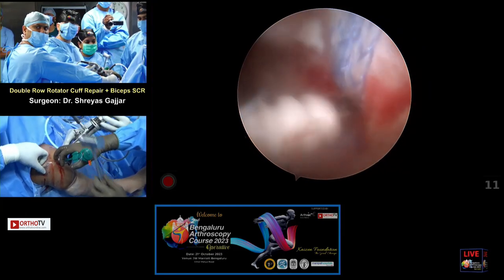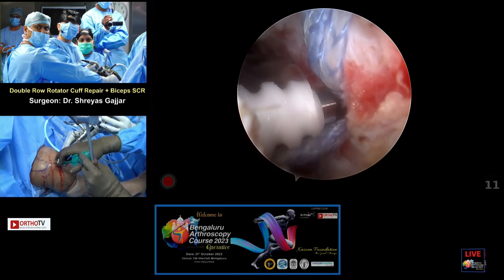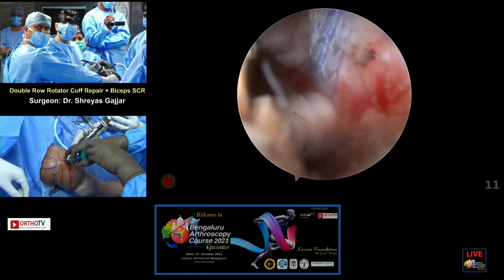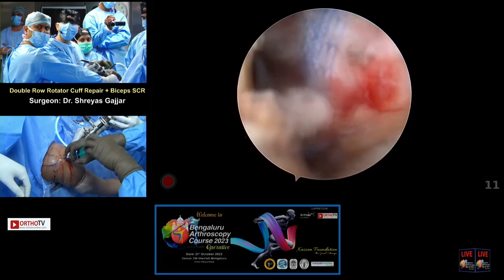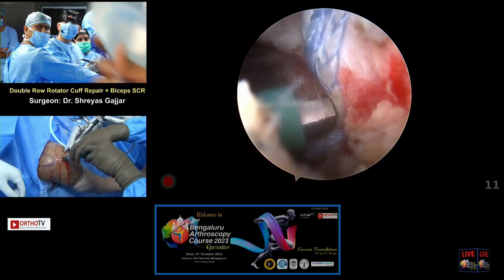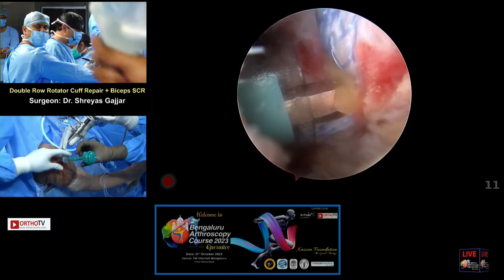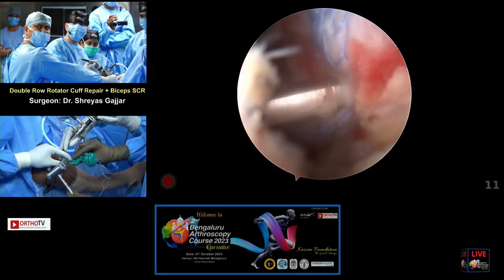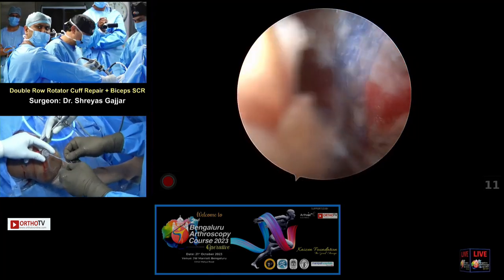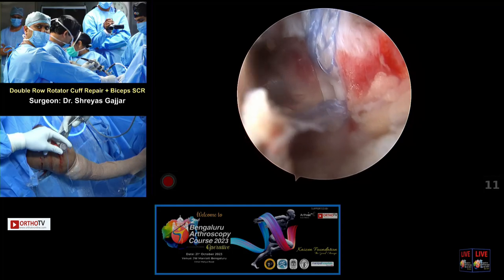That's fine, thank you. One other tip is if you have the cannula here, it may obstruct your vision. So you just withdraw it a little and gently tap it depending on the quality of the bone, and then you screw the anchor in like so. Okay. Hold the cannula, please. Again, when you are withdrawing the inserter, keep an eye that the anchor is not backing out. Thank you. Cutter, please. Mosquito.